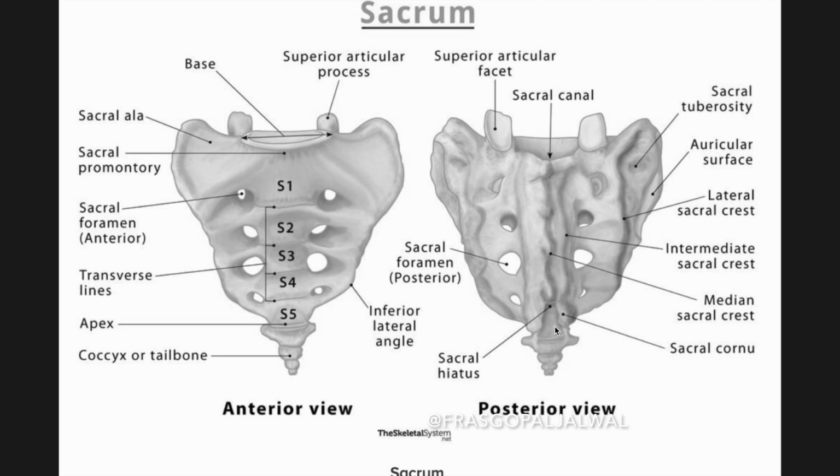In the caudal block, we have to puncture the sacrococcygeal membrane, and below that we have to deposit the local anesthetic into the sacral canal. The sacral canal is formed by the dorsal and ventral plate of the sacrum.